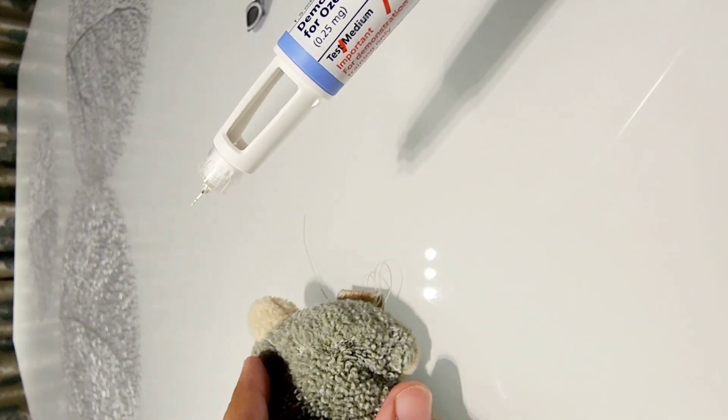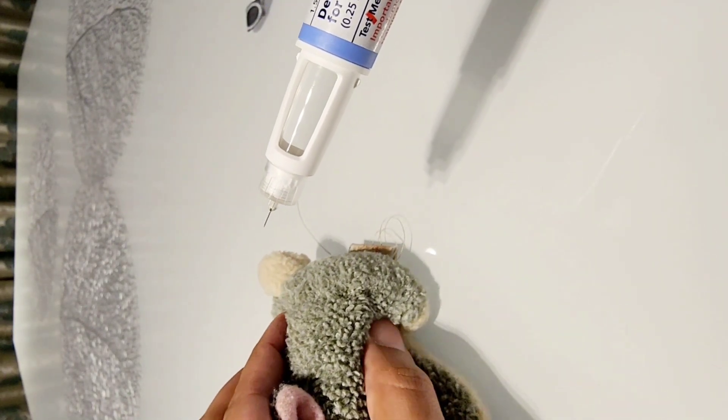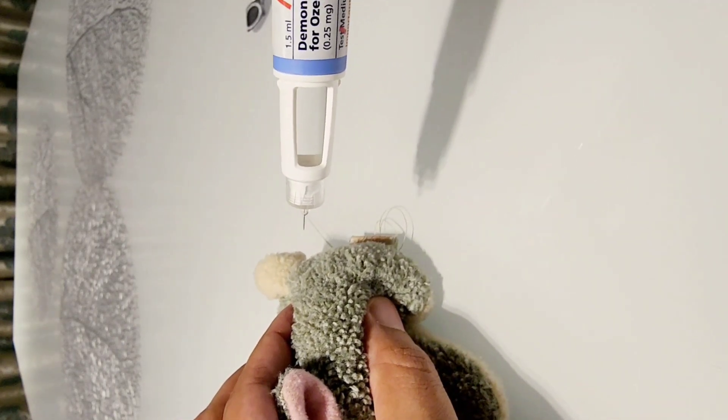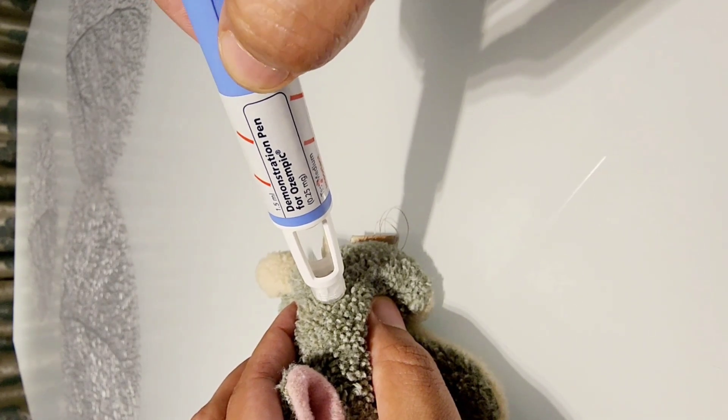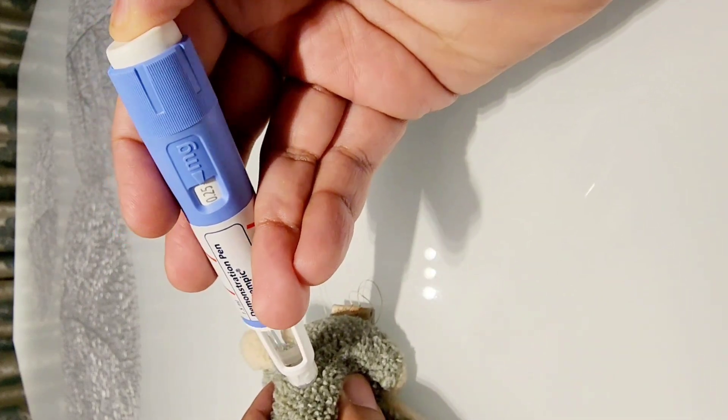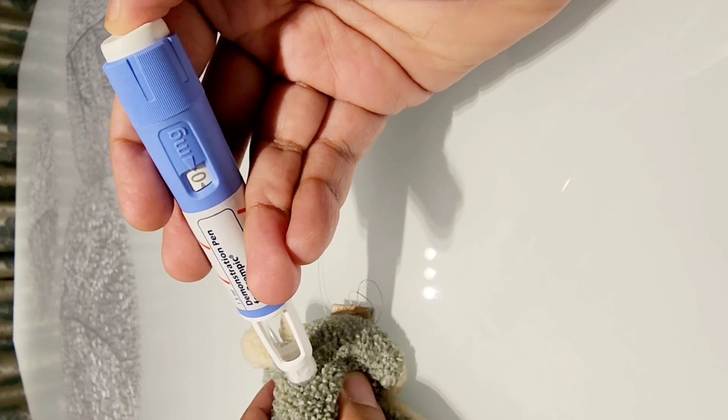Now you select the site which can be abdomen or your thigh or arm fatty bit. You will have to pinch a little bit of skin here because this doesn't have a flat surface like the pen for Manjaro. And this has to go perpendicularly into the skin.